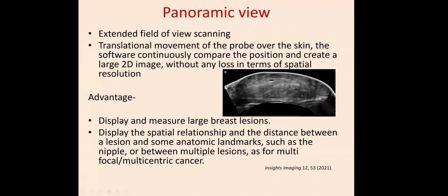You can also see the relations between multiple lesions, so you can tell whether it is multicentric or multifocal, which may not be possible with the dual screen or trapezoidal imaging method. So panoramic view is a very useful view. If you have that, use this also.